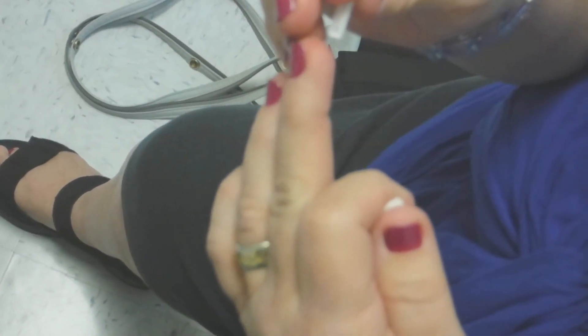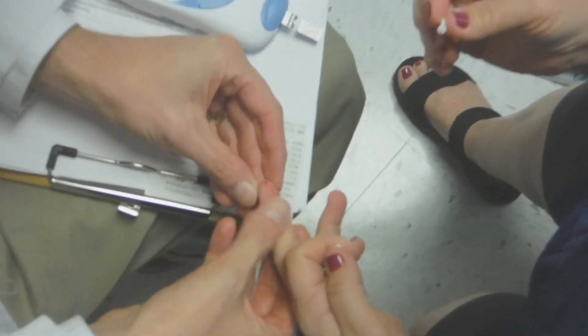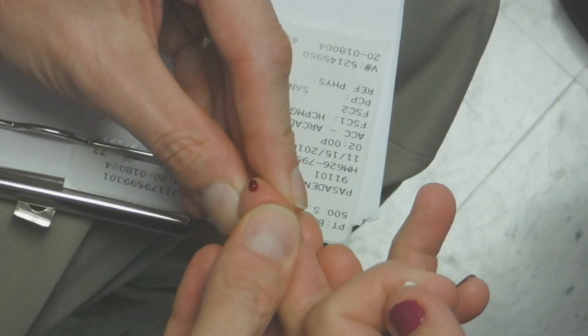I want to get some blood for you, because you have three minutes from when you hear that. How much blood do you need? A fairly good sized drop. I'm going to have to work on this one. If you put your finger down a little bit, it'll bring more blood. Oh my God, you're right! I was going to poke myself again.